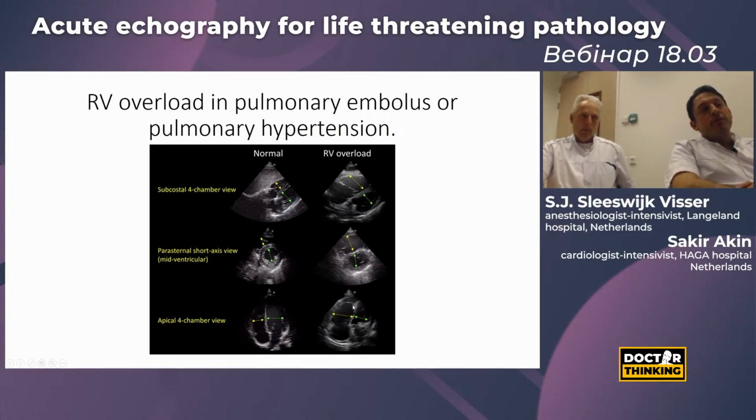In this view, an apical view is not even possible because the right ventricle is dominating the area. So you can't get a normal apical four-chamber view with a good left ventricle below your probe, but the right ventricle is enlarged and gets more space, which is a good sign of pulmonary embolism.